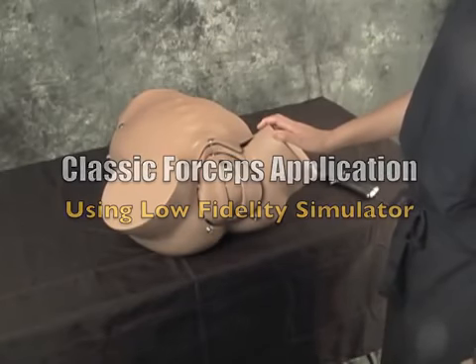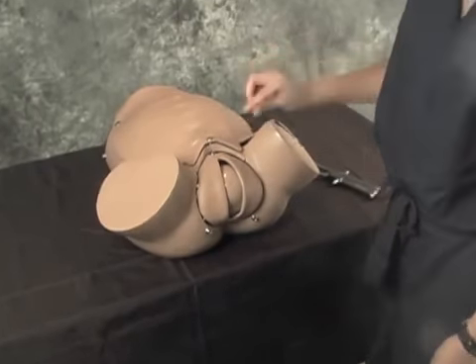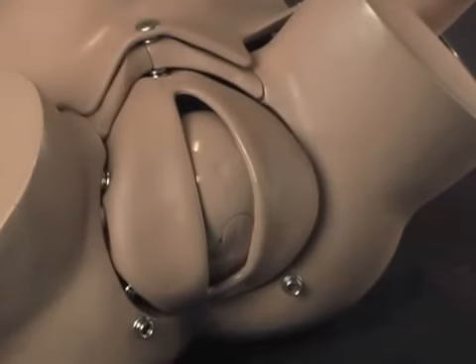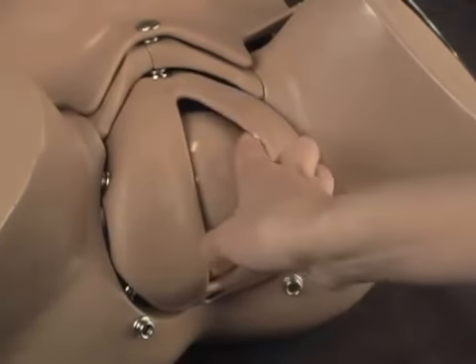Place the patient in the lithotomy position and ensure adequate anesthesia. Completely empty the patient's bladder. Check the sutures and fontanelles to accurately diagnose fetal head position.